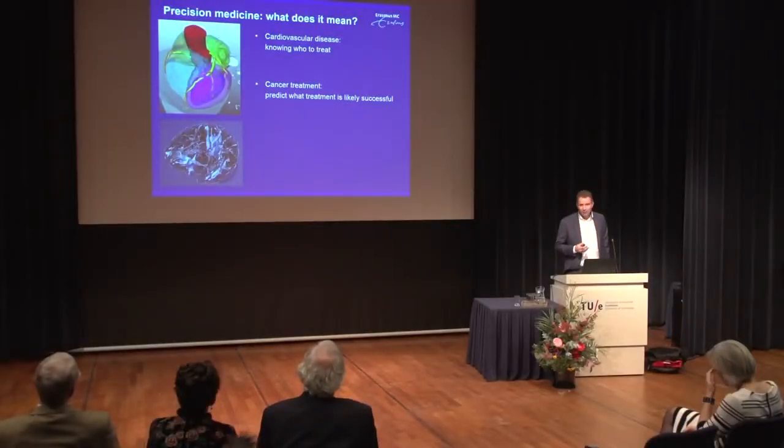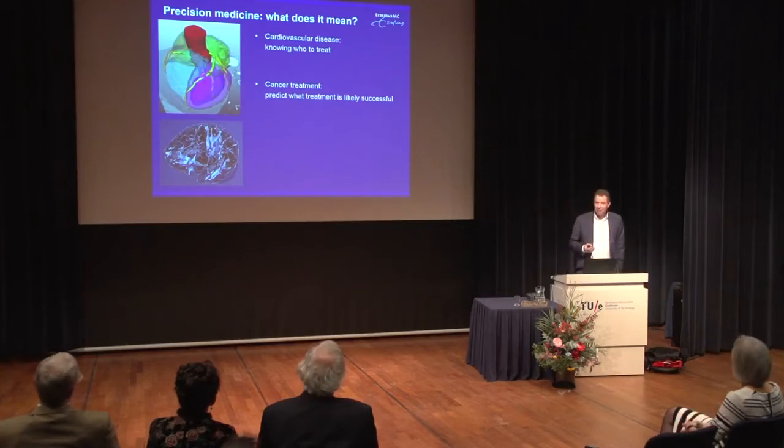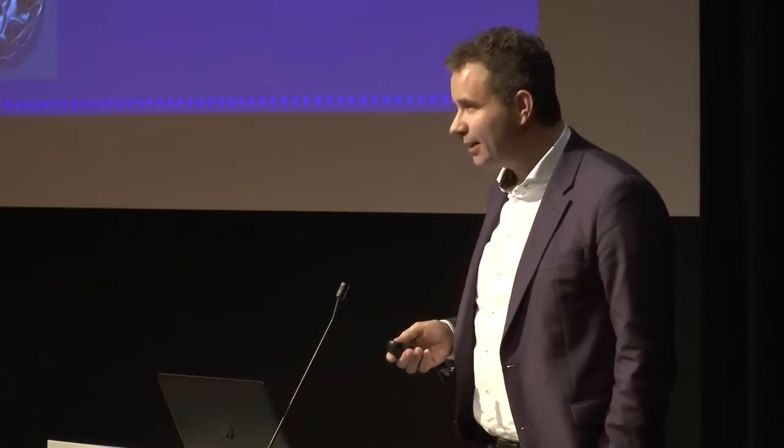If you look at cancer treatment, we know now that it's much more important what is the biological basis, the subtype of the tumor, than what is the location of the tumor. And in order to select the optimal treatment, we have to identify what particular tumor it is. This is often done with a biopsy, but imaging can increasingly be used to non-invasively determine the type of tumor, and in this way select in a non-invasive way the optimal treatment.